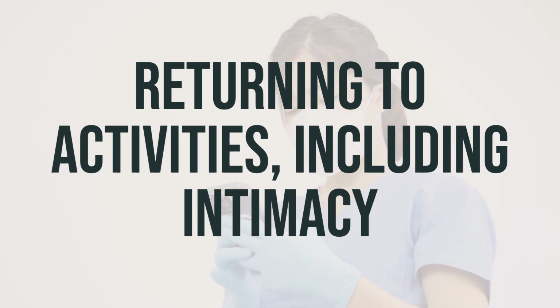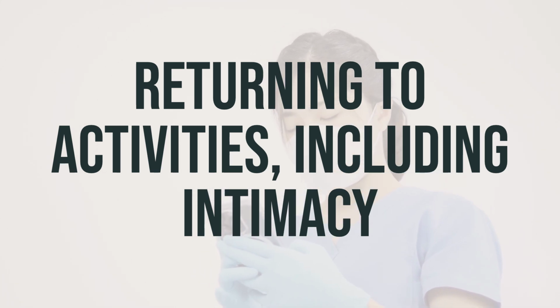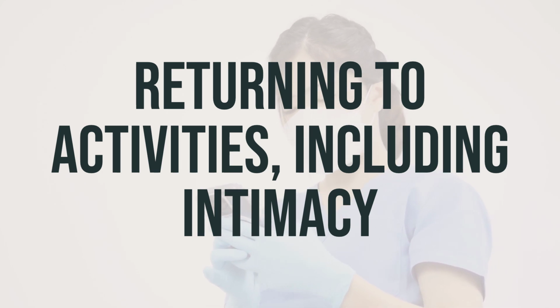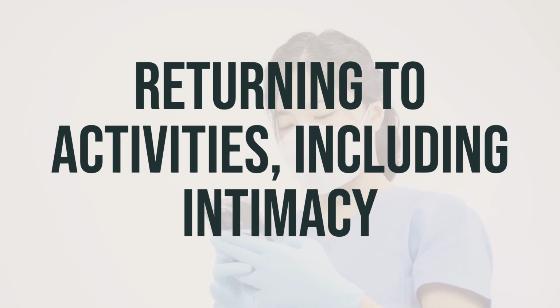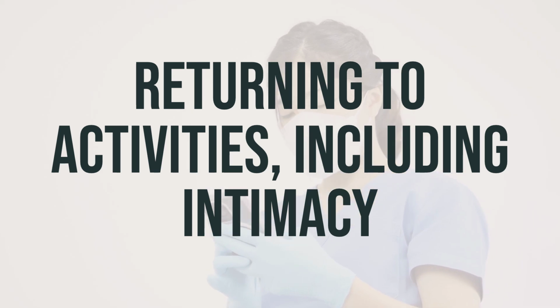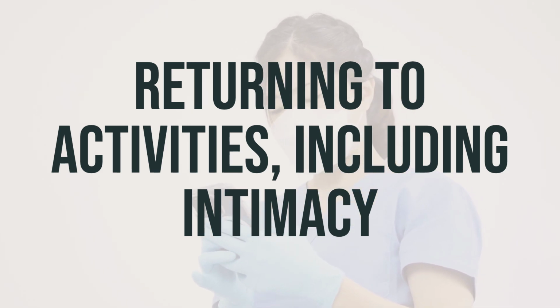Also, sweating could affect how your pouch sticks to your skin, so if you're working out, consider buying a special workout pouch. Next, let's address the myth about travel. It's not true that if you have a stoma, you can't fly. You can travel in planes, trains, automobiles, or any other way. Just be sure to pack plenty of stoma supplies in case of any delays, lost luggage, or other problems.